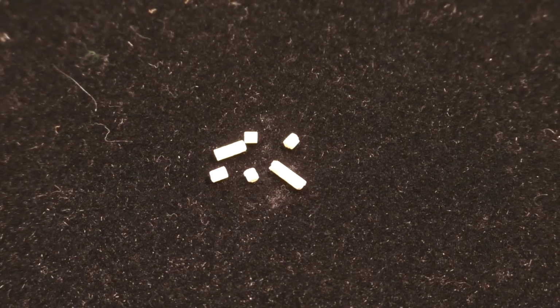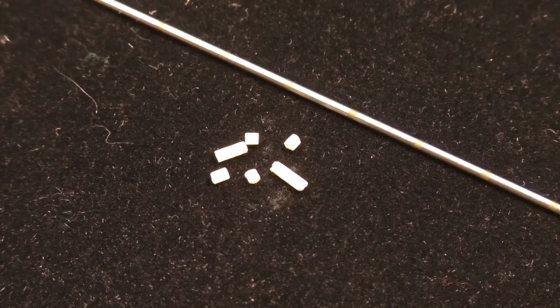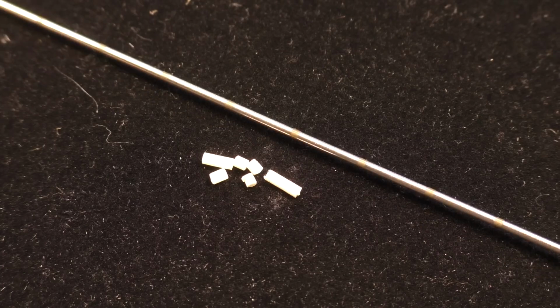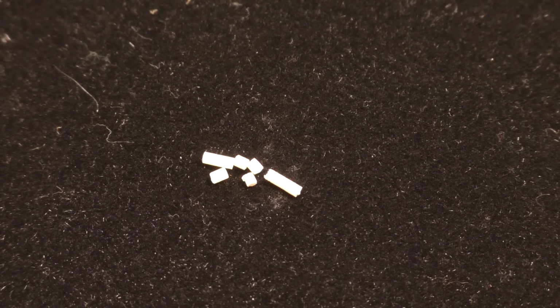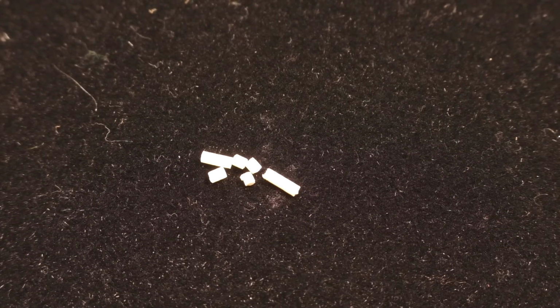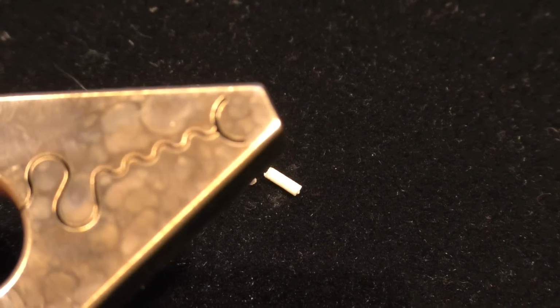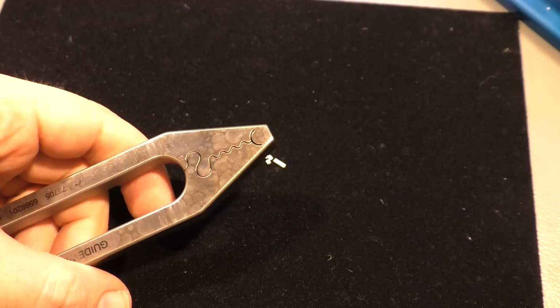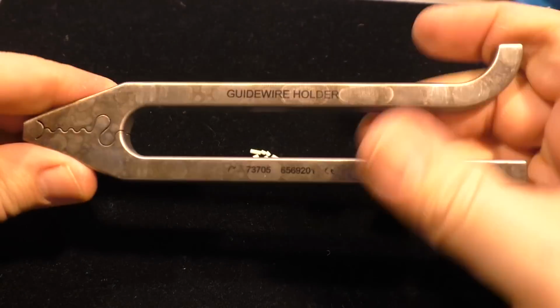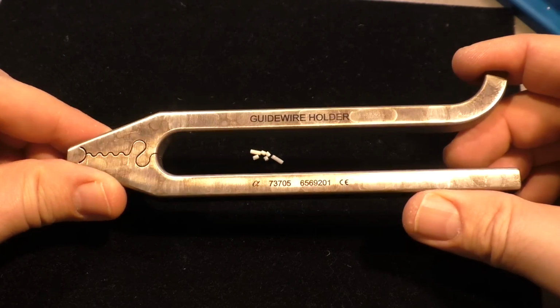Maybe it's actually made to recover some bone samples like this here. And the funny part is that the wires here that are supplied have exactly the same diameter, so they fit exactly through that hole in the drill. And with this special type of plier here, I was able to push that wire hard enough to clean these bone fragments. Maybe I'm misusing this guide wire holder. I don't know.